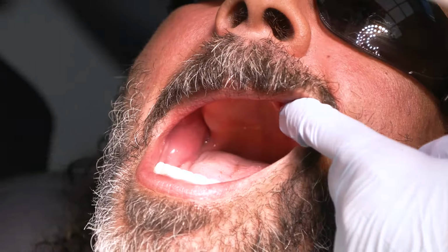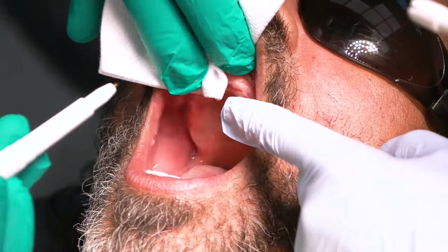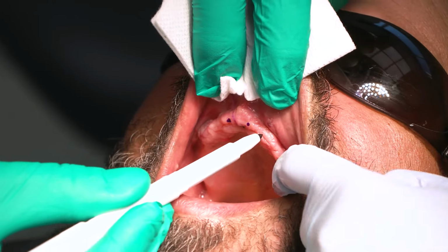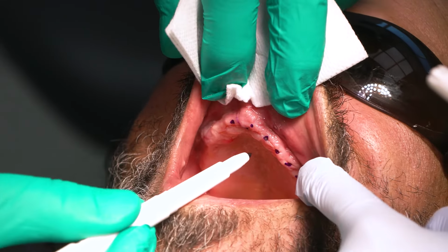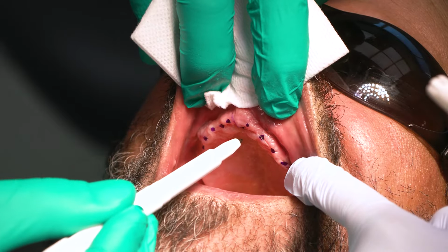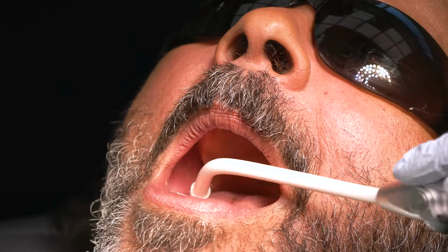Okay? I don't think we have room for 12, but we're going to do 10 implants. Let me have a marking pen. Thank you, Sonny. Okay. So I'm going to dry this here, and we're going to mark the locations of the implants. One, two, three, four, five, six, seven, eight, nine, ten. All right. Okay, so we'll start with the 2.5 11s.